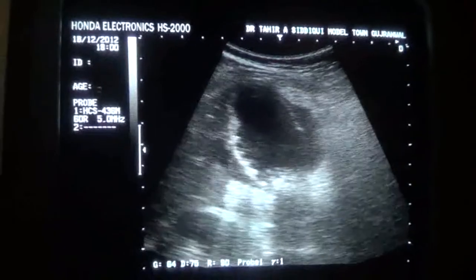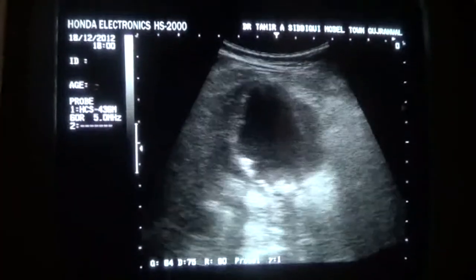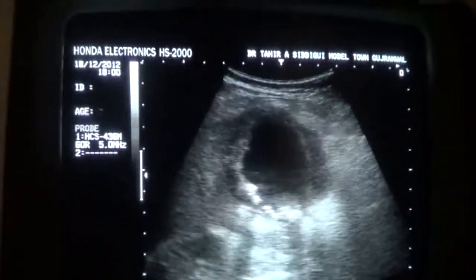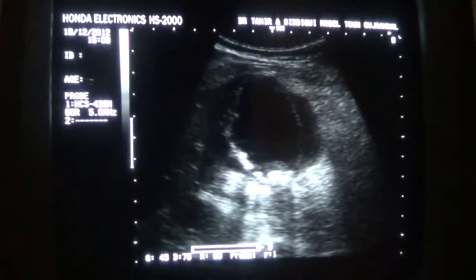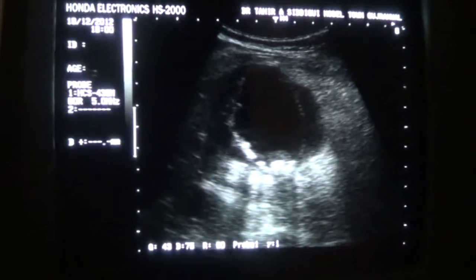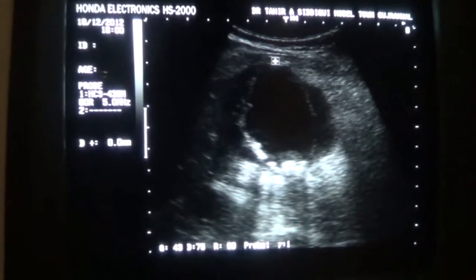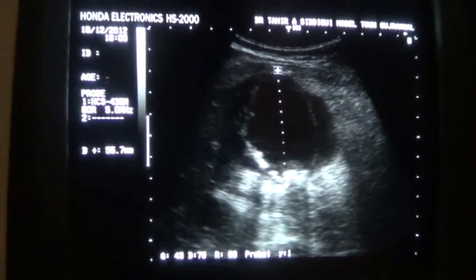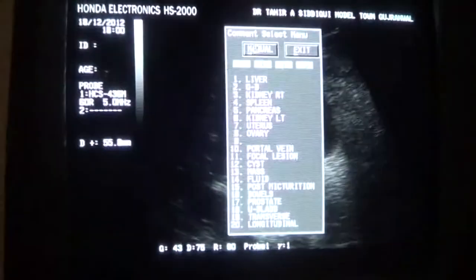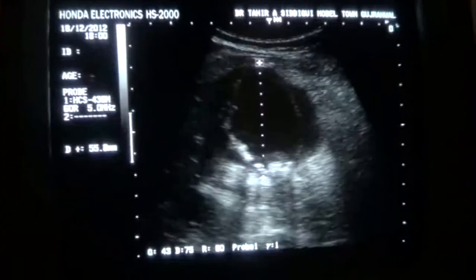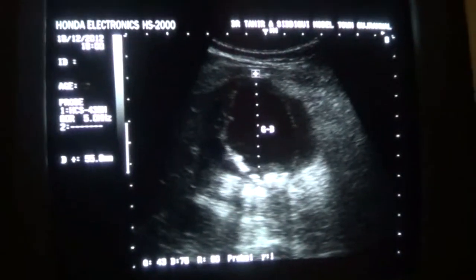You can see fluid all around the gallbladder with calculi suspended in the lumen. This is the transverse section of the gallbladder with the gallbladder measuring 5.5 cm — more than 5 cm is abnormal.